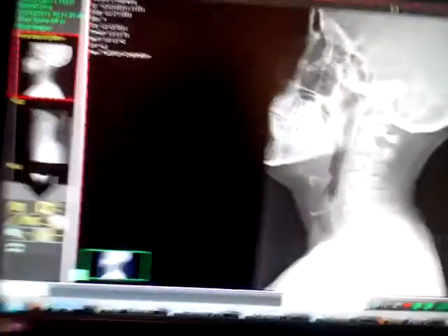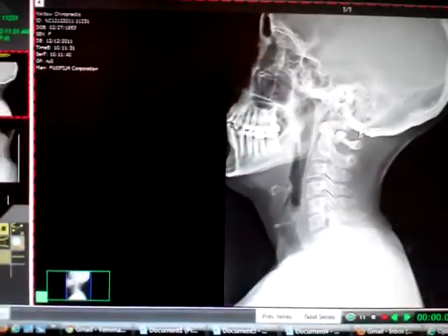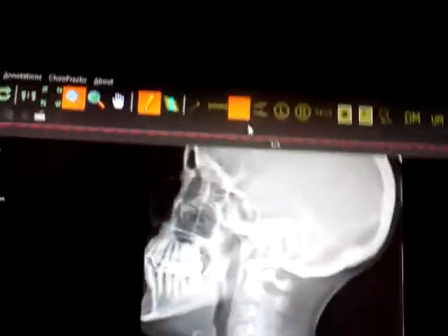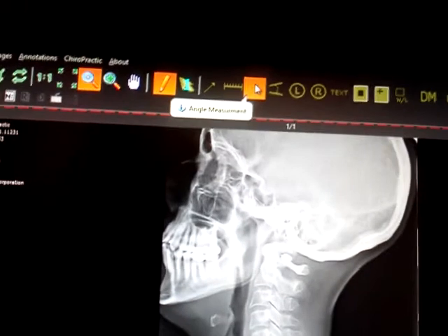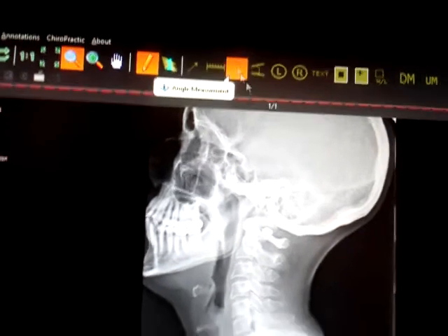Lateral cervical spine. First, open up the image that you want to mark. Go up to the top here — there's an angle measurement.